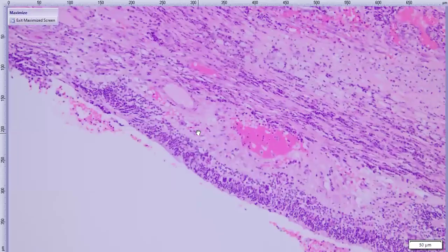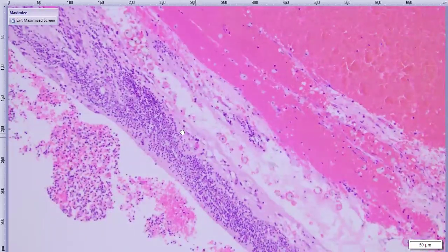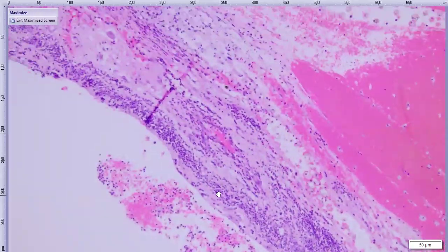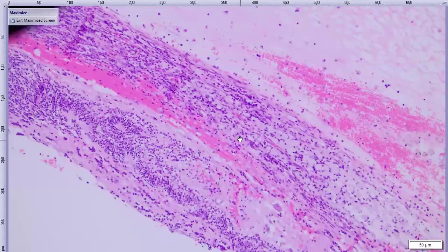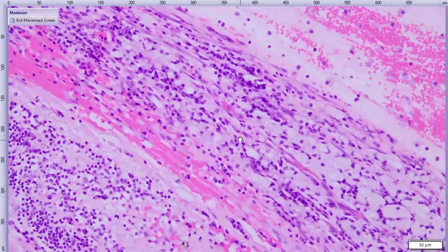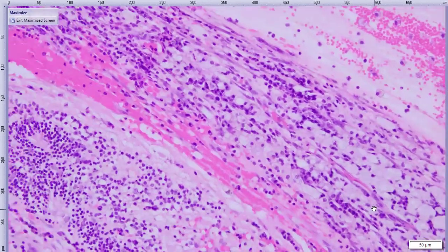But then when we look at the ventral retina, which is also detached, let me move out a little bit actually this way. So here's our detached ventral retina. As we move centrally, there's this extra layer sitting on top of it on the epiretinal surface. So there's this fibrovascular membrane. And within that membrane, again, just more lymphocytes, plasma cells, more of these weird foamy macrophages.